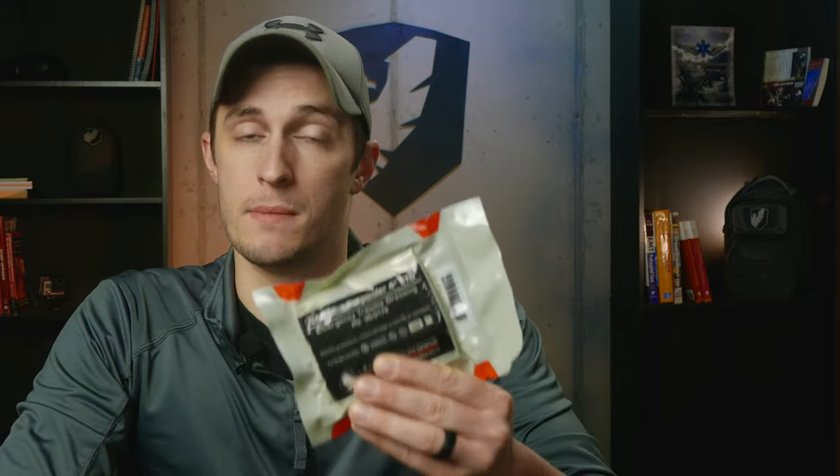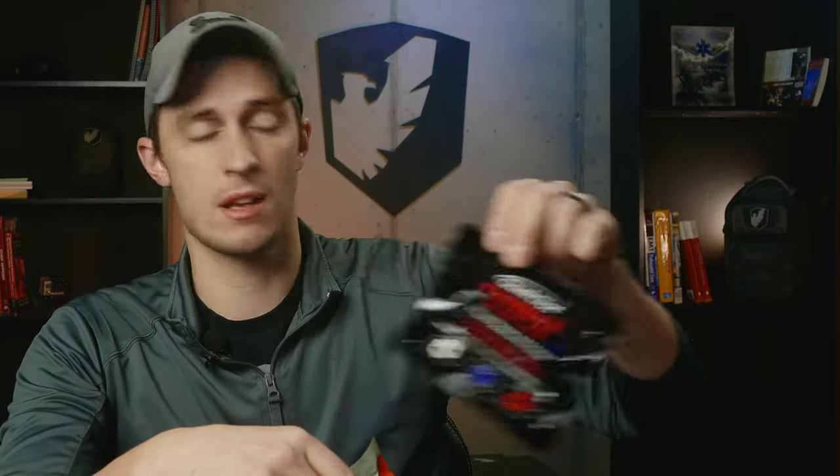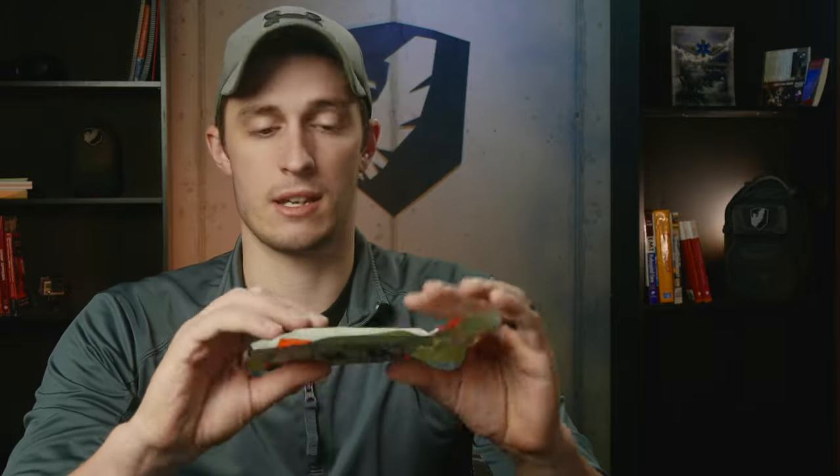This is the North American Rescue Mini Responder 4-inch ETD, or Emergency Trauma Dressing. This is a pressure dressing, so you're going to use this after you have wound-packed an arterial bleed with something like a combat gauze or C-LOX or something like that. This is going to hold firm pressure in there — it's an elastic bandage that will hold that pressure in place where it needs it.